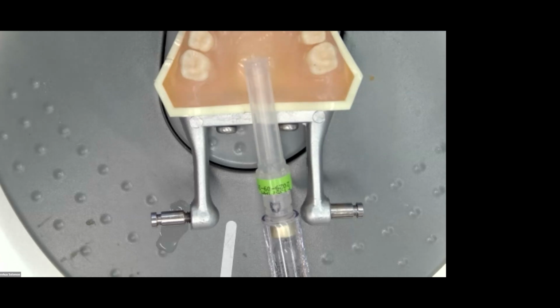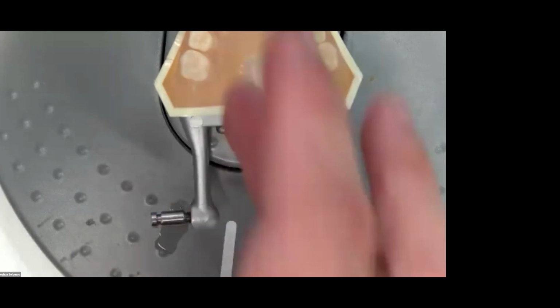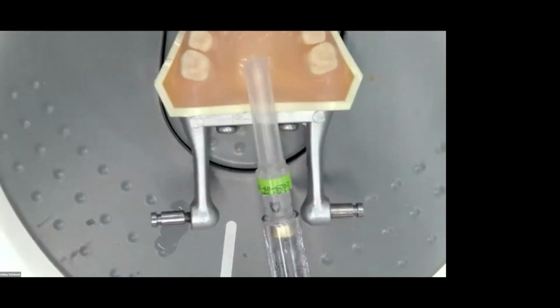So if you're worried about length of having that patient numb, you may, towards the end of the appointment, even if you're using the 1 to 100,000, just go back in the same hole, give a quarter carp just to kind of top them off before they leave. And I'll routinely do that if I think it's going to be a painful procedure.